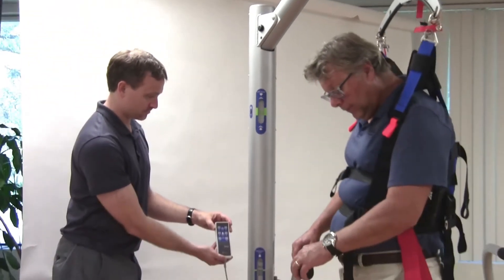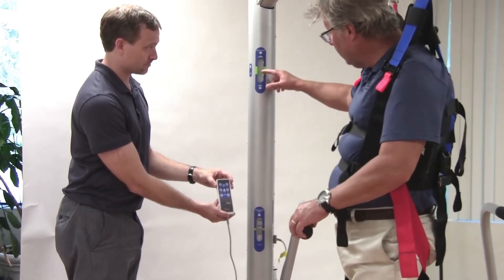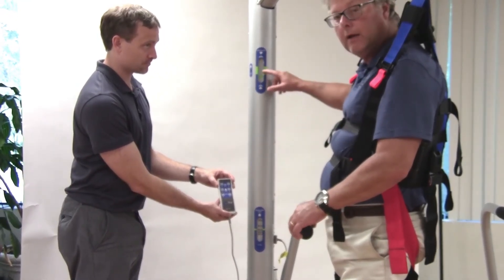If I lift myself up here, which naturally takes some load off, the bar moves down, so there's no automatic compensation in manual mode.